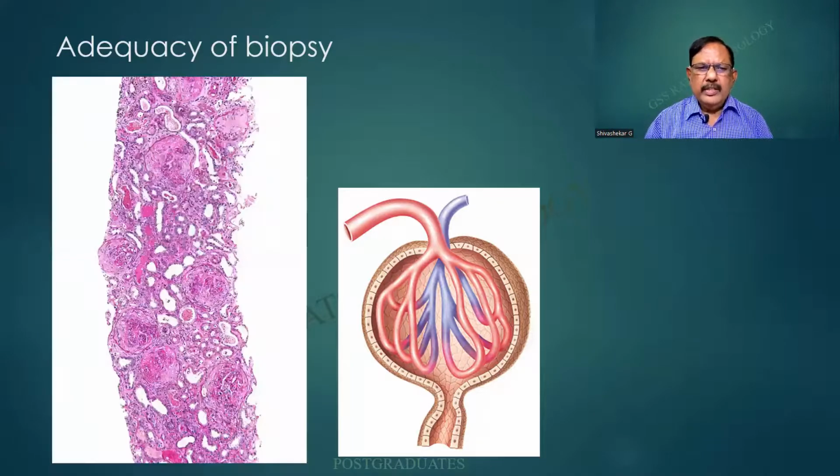Or look at this. One should definitely appreciate such biopsies. And my dear students, kindly be aware that the endoscopist, the radiologist, and the renal pathologist or the nephrologist, they are all of great advance in techniques. And look at the yield that is over here. I'm seeing 1, 2, 3, 4, 5, 6, 7 glomeruli in this. And how can one say that it is not adequate?